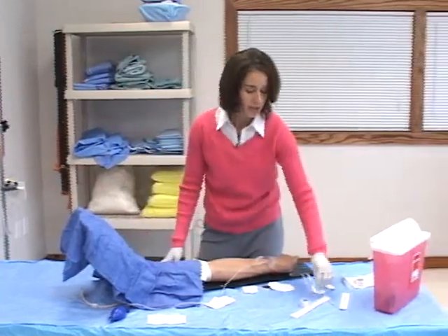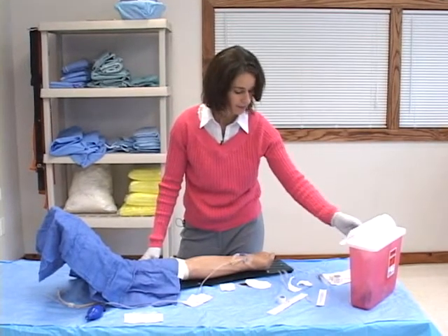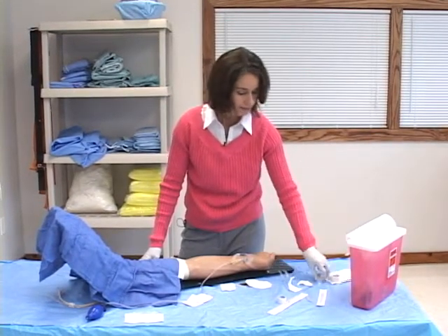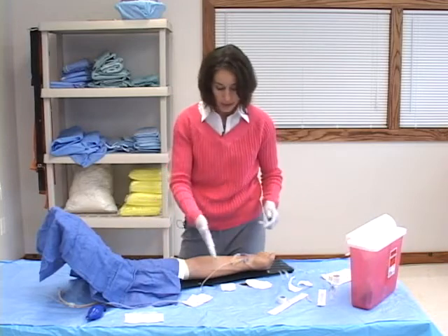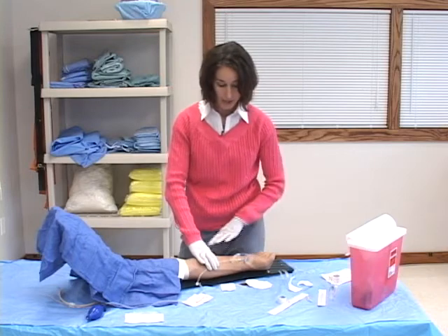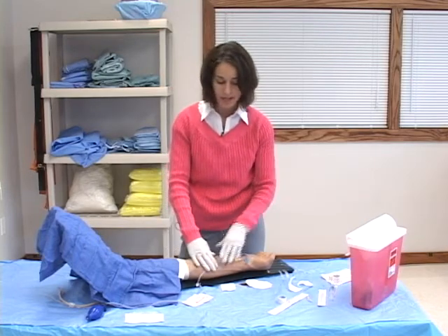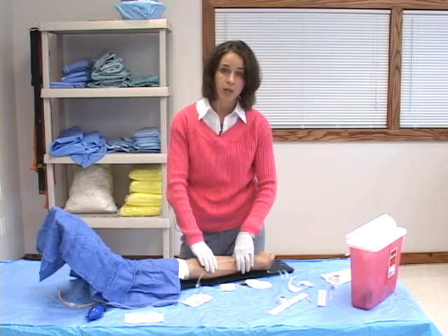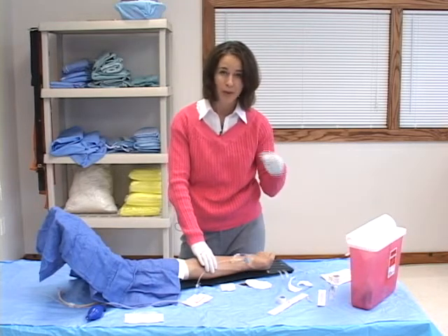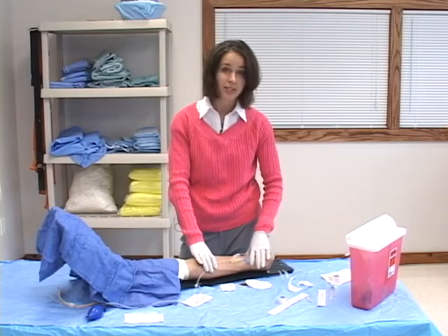And you want to make sure that you do dispose of your sharps into the sharps box. And then you see the fluids running easily into the patient's arm. Usually with a pediatric patient, it would involve a lot more tape. If you do go into the antecubital fossa or around any kind of joint space, you probably want to do an arm immobilizer so the patient can't wiggle and take out that IV. You have your fluids going in and you have successfully started an IV.